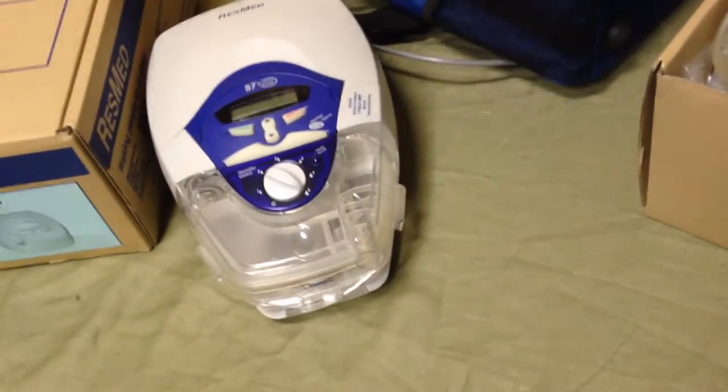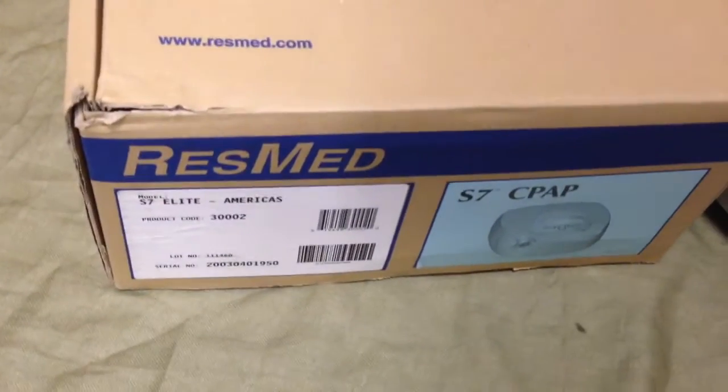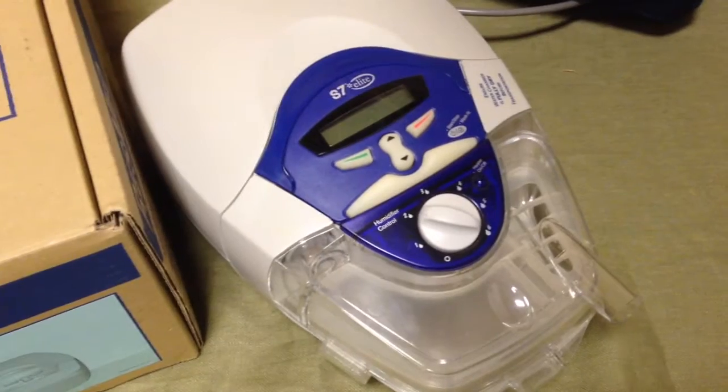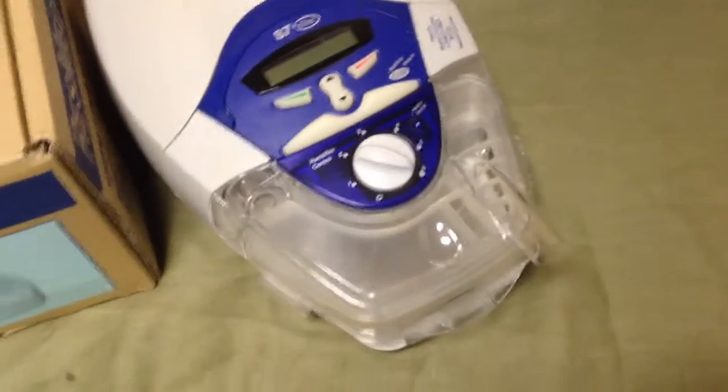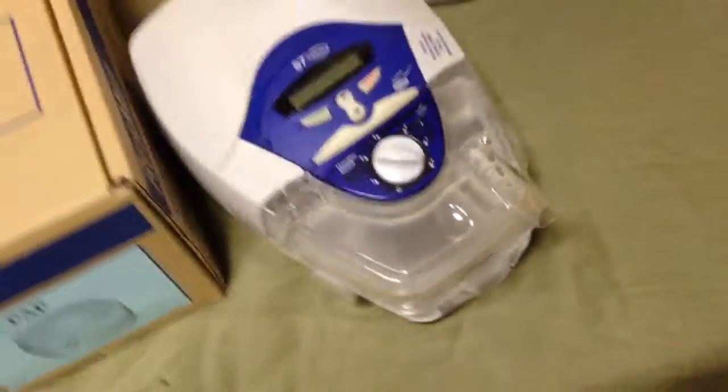Now every year ResMed puts out a new one, and basically the idea behind that is the same reason they put an iPod connector in your car — to give you a reason to go out and buy a new one. But by and large, these things work the same year after year. You can go buy a new one, God bless you, but if you want to save some money and deal with your sleep apnea, then this is where it's at.